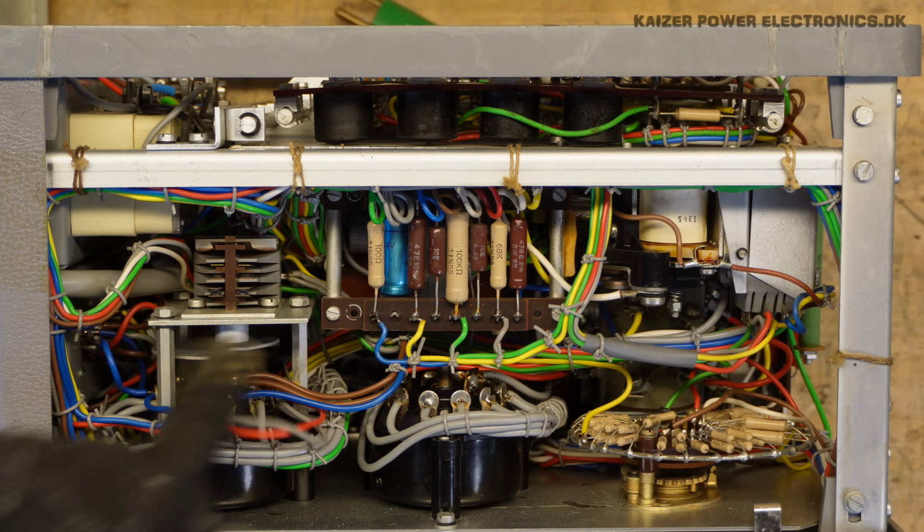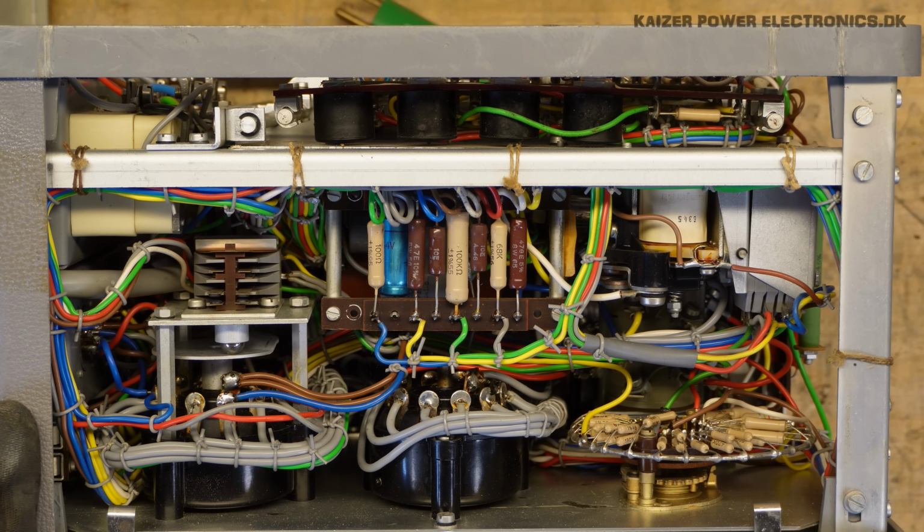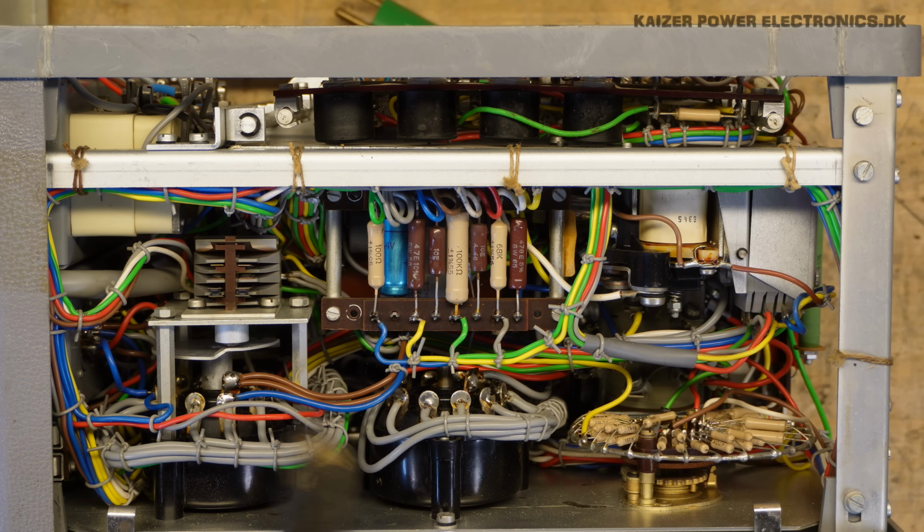We can see we also have some cam wheels sitting down here, making some selections on a switch behind it. So this would be the highest setting. And then we go lower, lower, lower, lower, and it switches over to the small focal point. So this is our large and small focal point selector. Small focal point does not need as much voltage and current. In the middle we have the voltage adjustment. So that's also the gray wires, and just seems to be, I guess, a multi-tap point selector on the transformer.